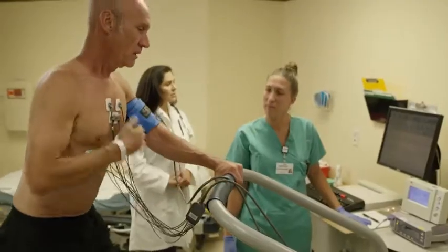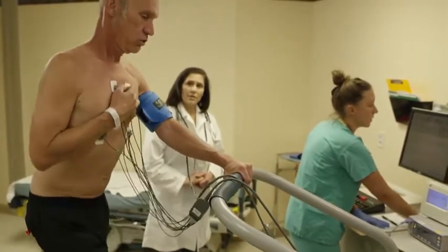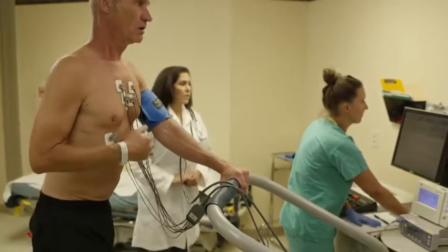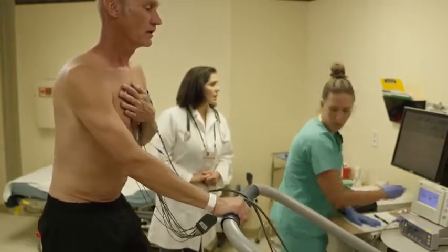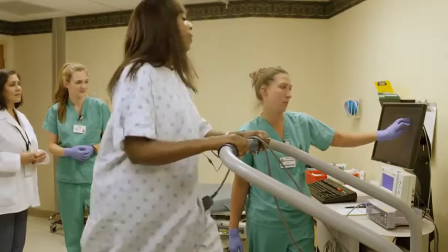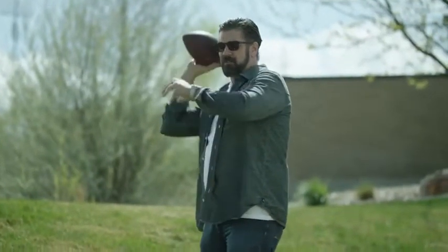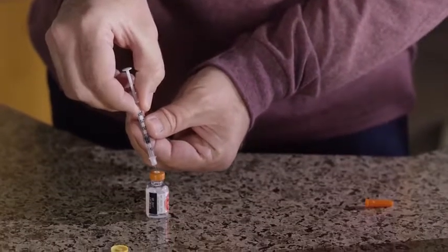This may cause symptoms during exercise, like chest pain or shortness of breath. The test can also find out if your treatments for heart disease are working, and it can show if you need other tests to look for narrowed arteries. You also might need an exercise stress test to show how hard you can safely exercise, or if you don't have symptoms but have risks for CAD, like diabetes.